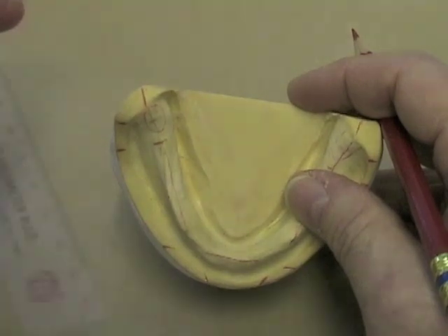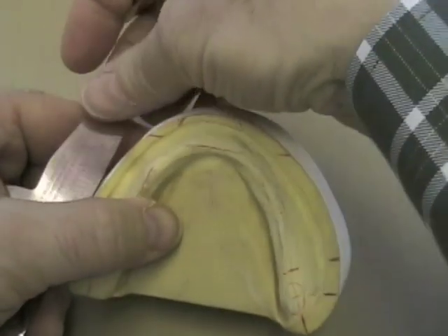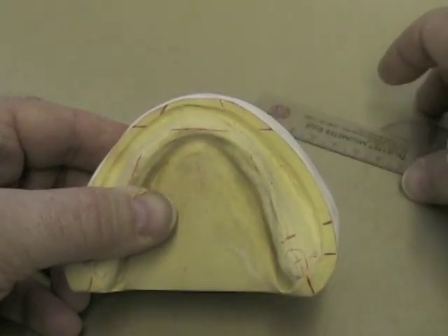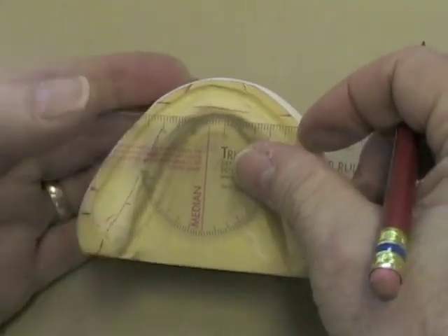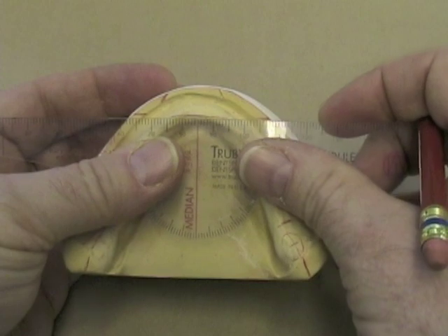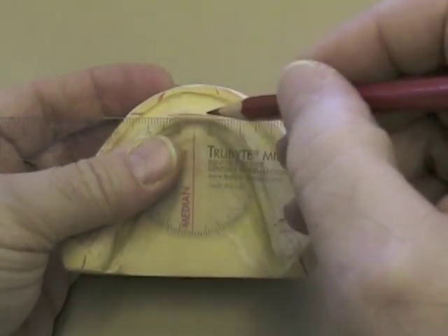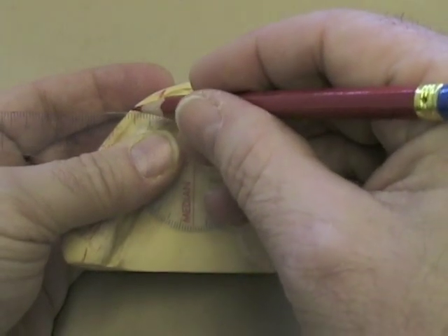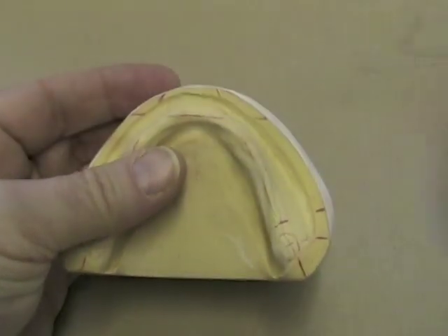Turn your cast around, look at the anterior portion of the ridge, and determine where that is. This line will help you determine where your lower incisors are in relationship to the ridge. Take the midpoint of your best estimate of where the center of the anterior portion is, and draw a line out onto the land area and across the ridge.